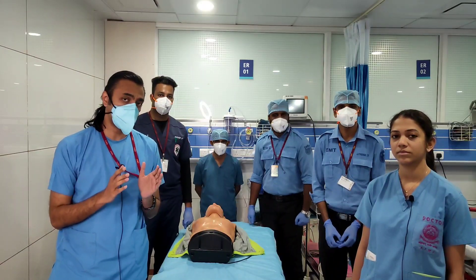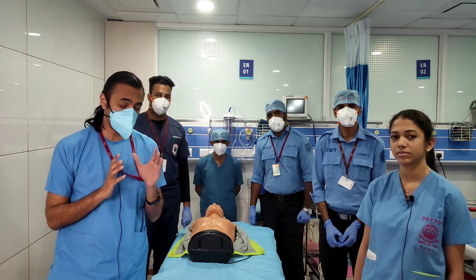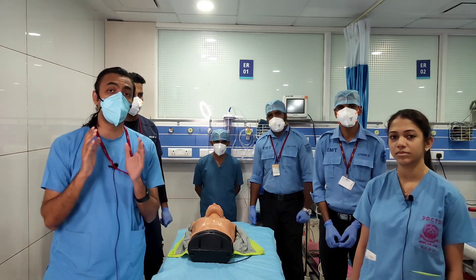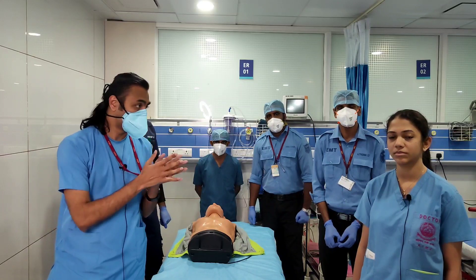So now here we will try to replicate an ACLS scenario where the rhythm is a PEA or an asystole. Over to Dr. Manna.